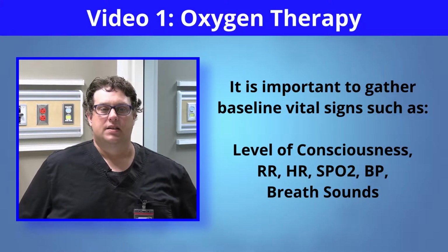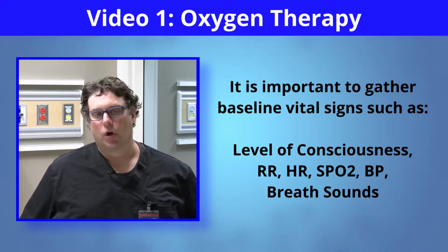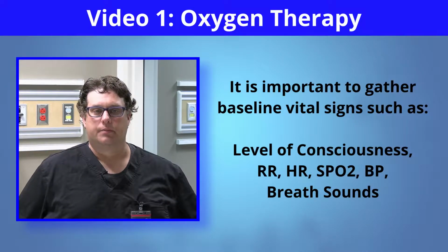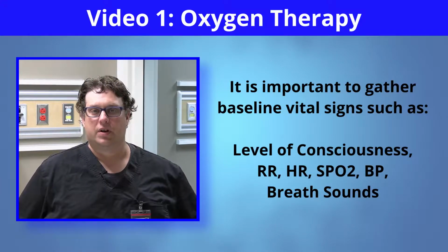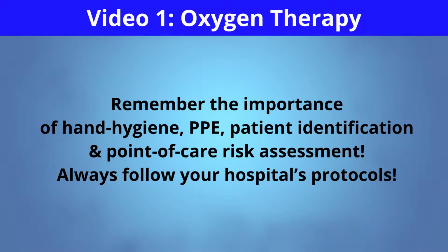patient. Next, you want to move on to assessing their breath sounds and looking at what their work of breathing looks like, and we'll discuss work of breathing shortly. If they're requiring oxygen therapy, what are their FiO2 that you're going to be applying or what they're on? What type of oxygen therapy are you applying, whether it's nasal prongs, Venti-Masks, non-rebreather, or high-flow oxygen therapy. And you're also going to look at your accessory muscle use.